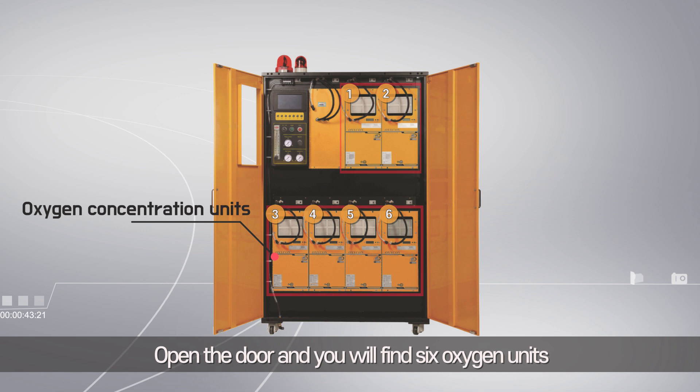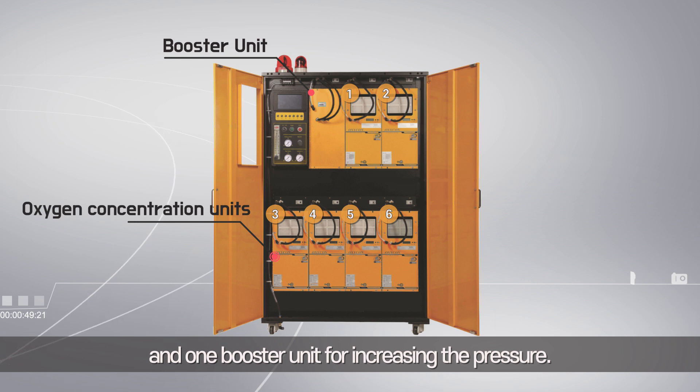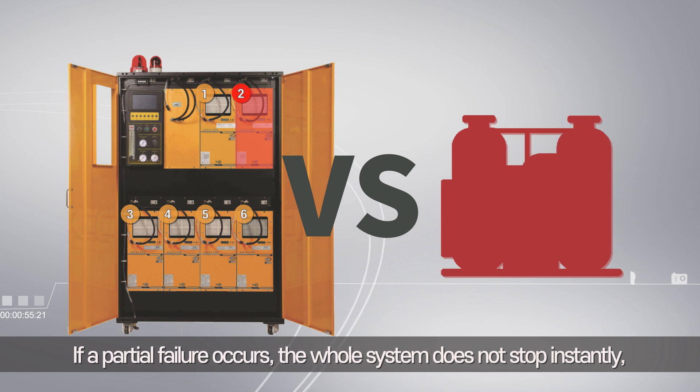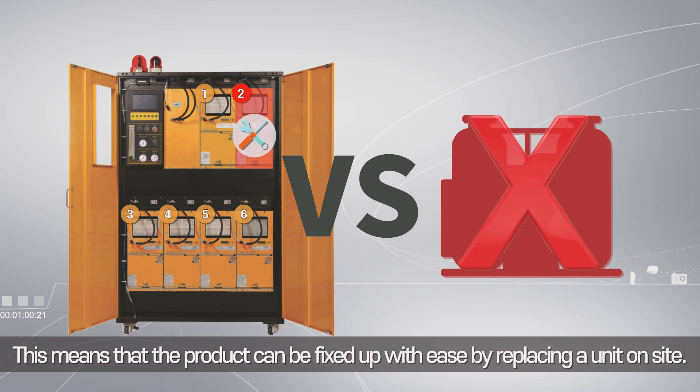Open the door and you will find six oxygen units that concentrate the oxygen and one booster unit for increasing the pressure. If a partial failure occurs, the whole system does not stop instantly as the units are combined in a parallel manner, meaning the product can be fixed up with ease by replacing a unit on site.